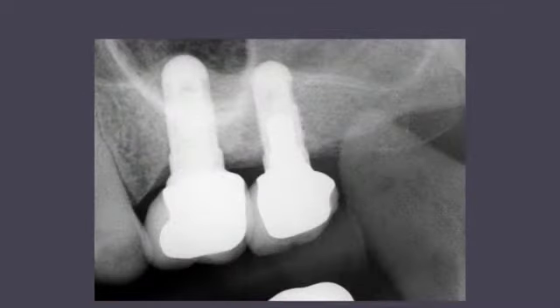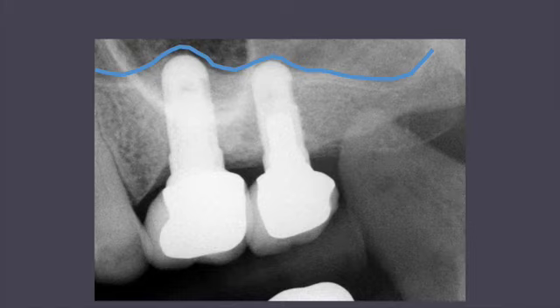You can see on the radiograph two important features. Number one, that the implant itself is fully invested in living bone, and that the living bone is of an architectural pattern that supports the concept that living bone has grown towards the implant cylinder. The second feature we can see is that the sinus floor has reconstituted itself just above the hemispherical apex of the implant, and there is a continuity of the sinus floor itself.